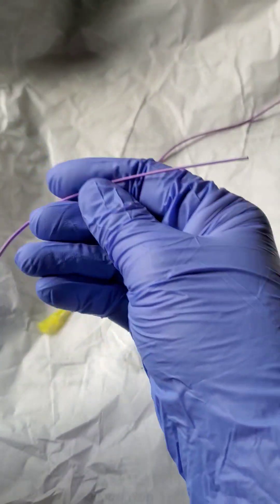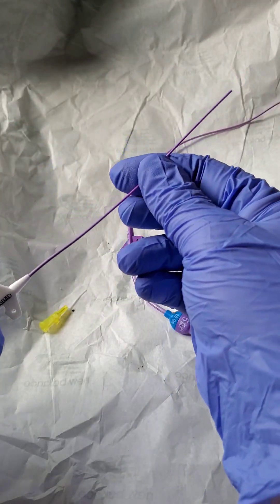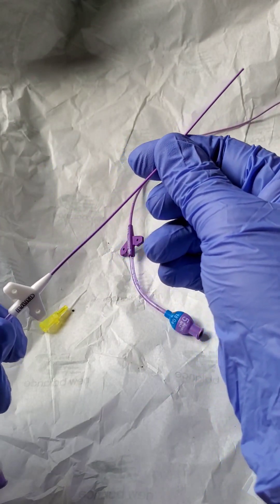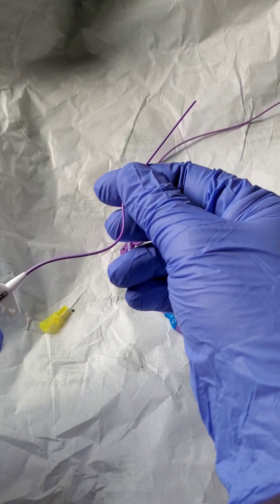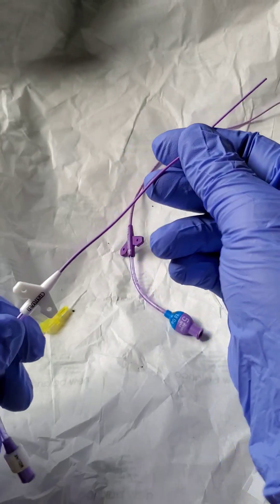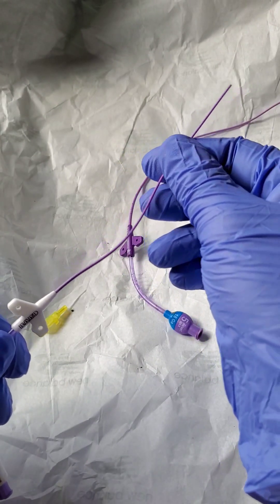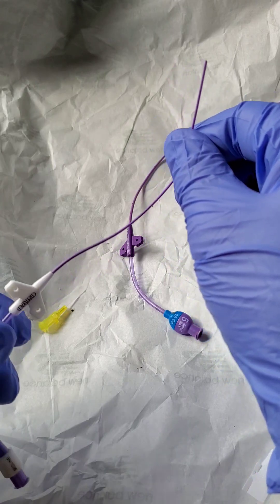And the midline is what I call a glorified IV line. It's twice to three times as long as the simple IV, and it simply provides more secure access into the vein. It does not go past the armpit. It should not.